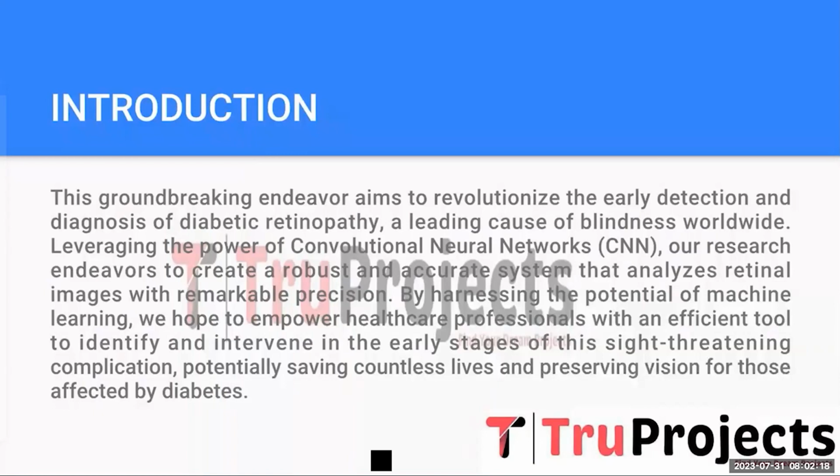Leveraging an extensive dataset of retinal images, our goal is to develop a robust and accurate classification system. By comparing the performance of diverse algorithms, we strive to identify the optimal model for diabetic retinopathy classification. This project holds immense promise in revolutionizing healthcare by enabling timely diagnosis and intervention, potentially preventing blindness and improving patient outcomes.